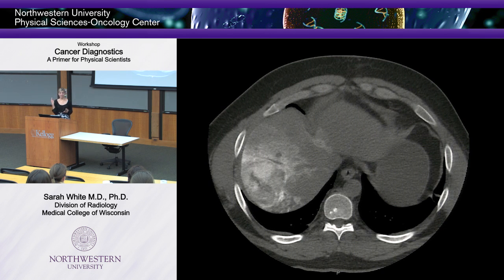Looks like I made a mess, doesn't it? Well, that's what it looks like, okay? You go to the territory of the tumor, and then you just inject, and it goes where it goes. And you can see here's the tumor. I wish the tumor looked like a light bulb, because that would have meant that it all went to the tumor, but it actually goes to the normal liver also, okay?